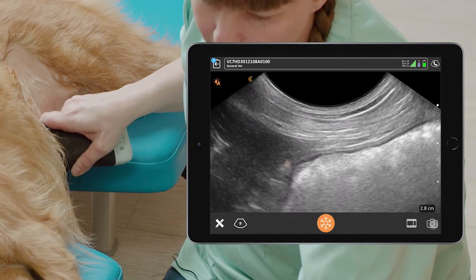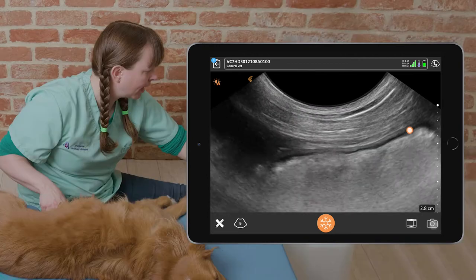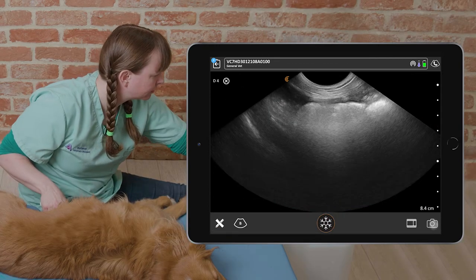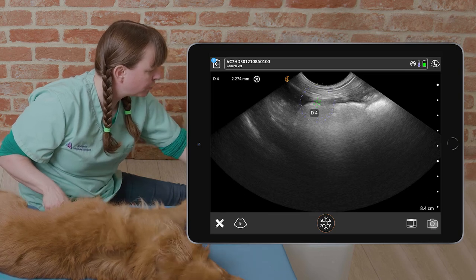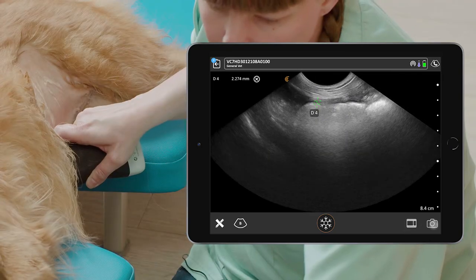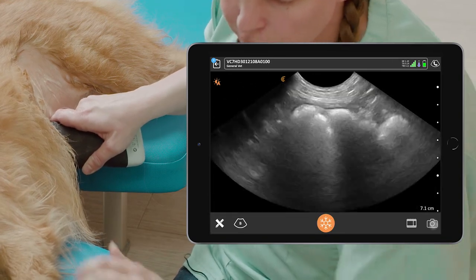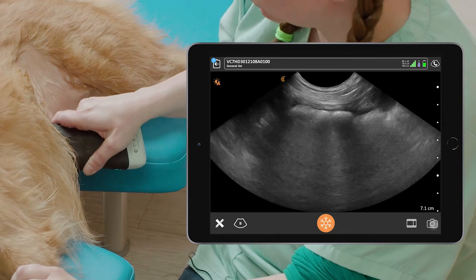We can reduce our depth so that we can see the wall of the stomach, and then we can take a measurement from the lumen up to the serosal layer. If we increase our depth we can have a look at the full stomach.